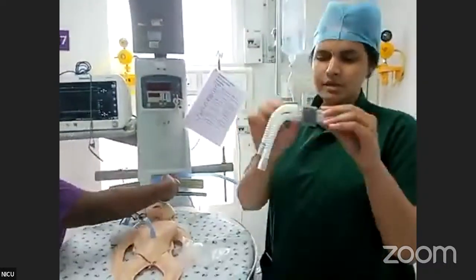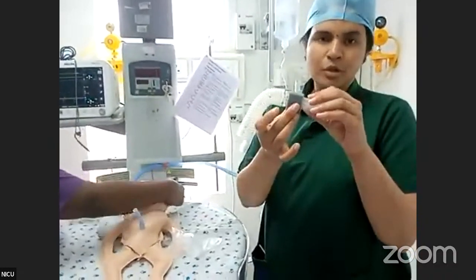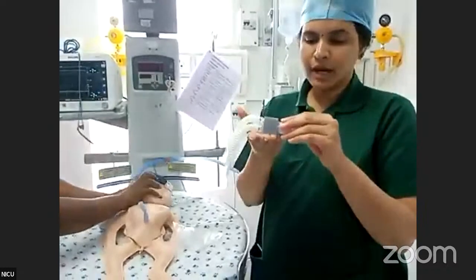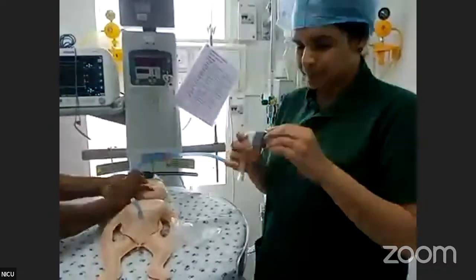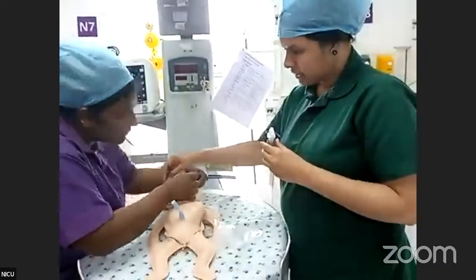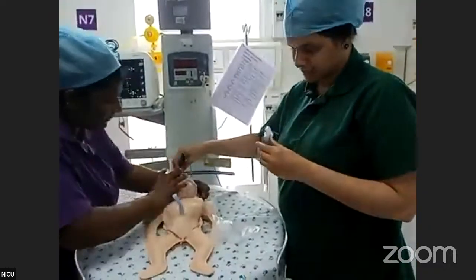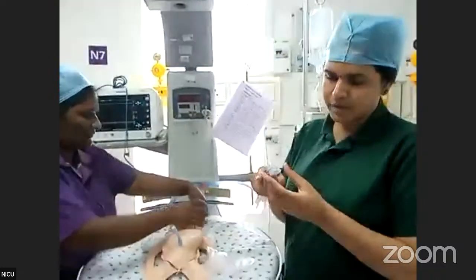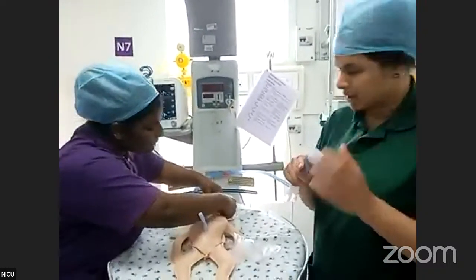This comes with these soft sponges which are detachable. So based on the height that is required, we can either detach or leave them attached to the baby. And this will lie over the central part of the CPAP cap. And at the end of this, we have small connectors here, which will go with the hinges of the nasal interface.